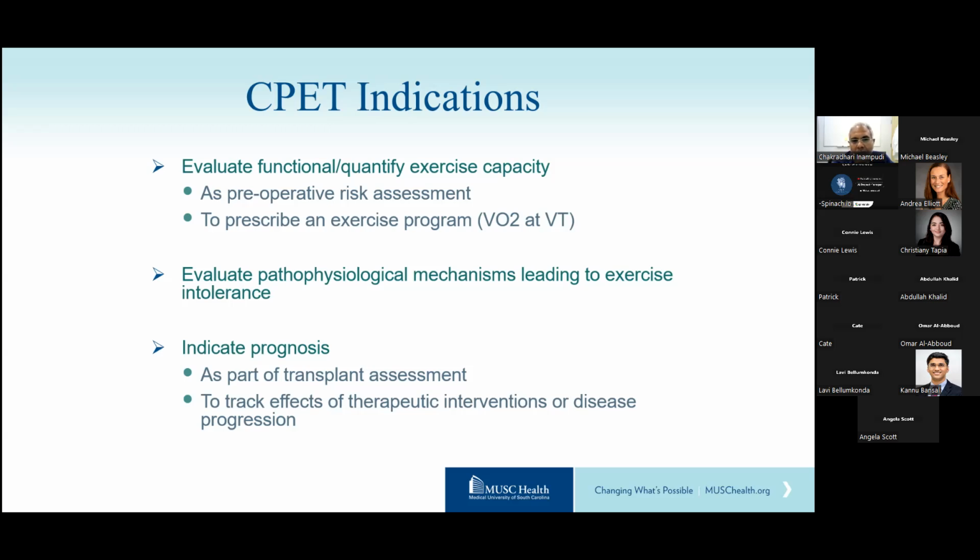The CPET will also help us to understand or evaluate the pathophysiological mechanisms that are leading to exercise intolerance in the patients. And as heart failure cardiology fellows and faculty, we spend a lot of time assessing patients for cardiac transplant and also tracking the effects of therapeutic interventions or disease prognosis progression.